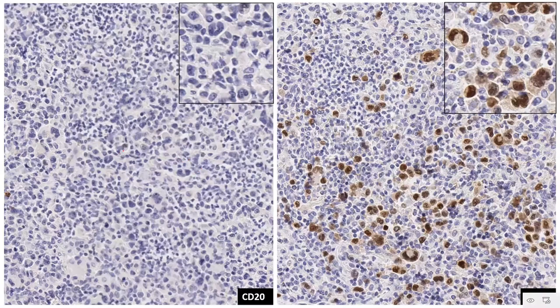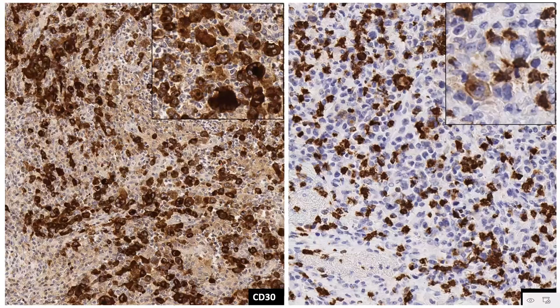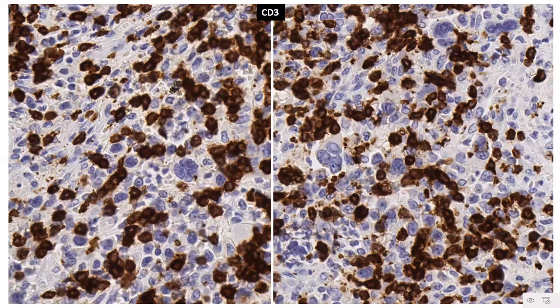CD20 shows you a negativity, as is expected in these cases. The MUM1 shows a strong nuclear positivity in these cases. CD30 shows you a strong expression in the membrane as well as in the Golgi zone, and CD15 also shows you a strong positivity in the membrane and in the Golgi zone. CD3 just highlights the background population, the scanty background population of small lymphoid cells. Keep in mind that in this subtype, usually the background population of small lymphoid cells is scanty.